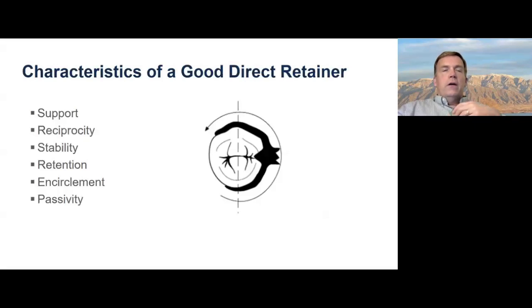So a good direct retainer is going to have a few aspects to it, and let's talk about some of these. Encirclement, I'm not necessarily going to go through all this. Support is, I think, kind of obvious.